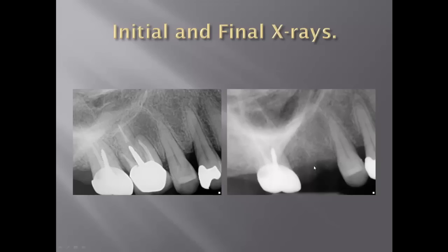On the next slide you can see the picture before and after I filled with a bone graft. You can see that even in a regular picture it's very hard to tell that you have this lesion, but that's why the 3D is handy to check the area, and it shows there is a big infection over here with a vertical fracture. Thank you.